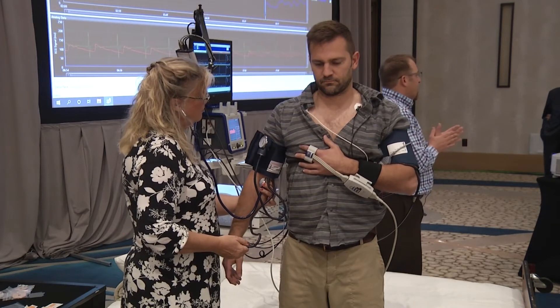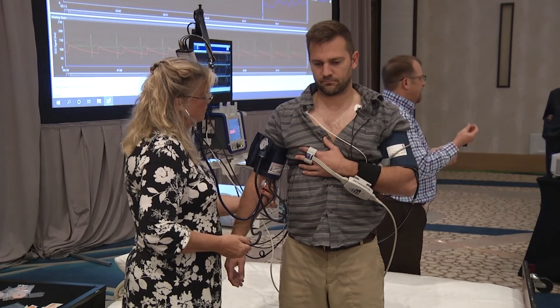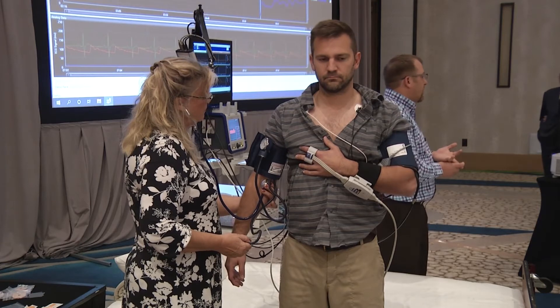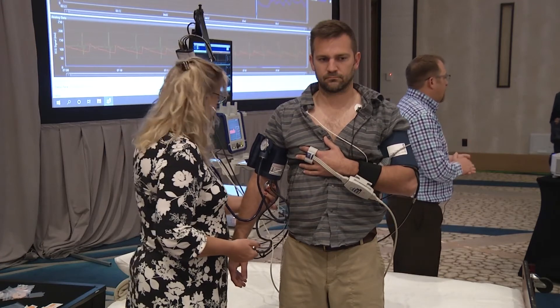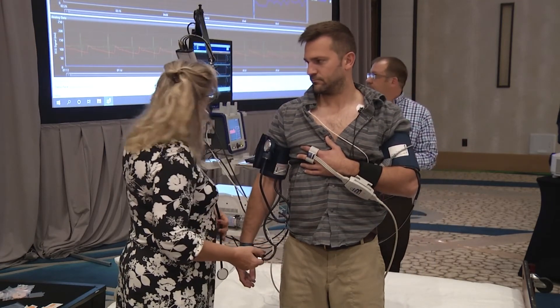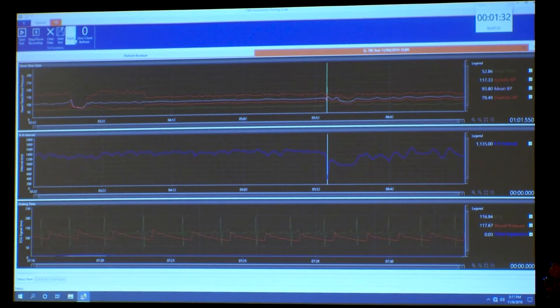The device works through standard blue latex gloves but will not work on the purple ones — at least the last time I tried, it did not work on those thick purple chemo gloves. Through the blue gloves I got 142 over 82.